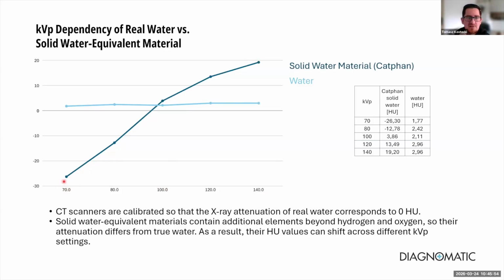So this is a chart which shows the real water to solid water equivalent. So it doesn't always show true 0.